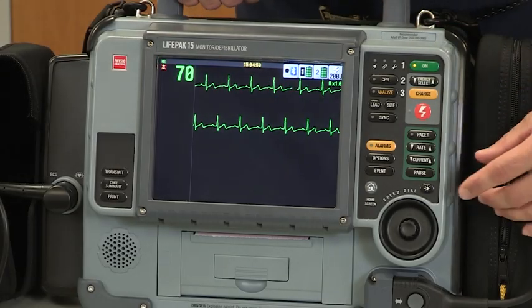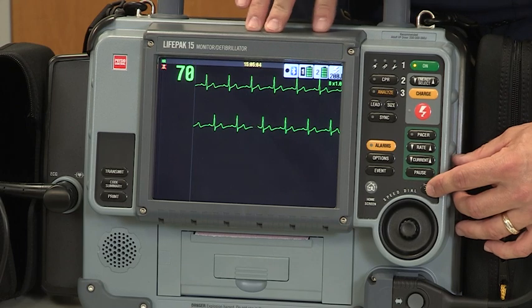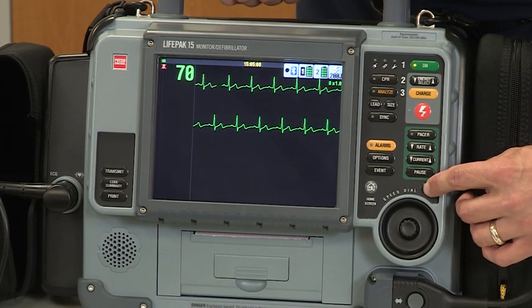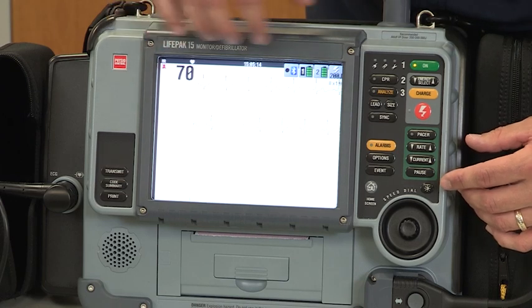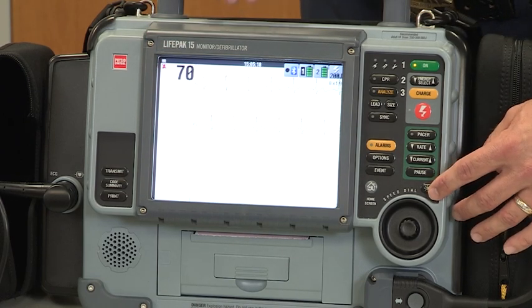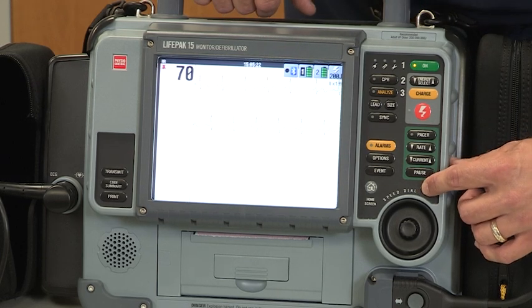Another option that's new to us on the LIFEPAK 15 is the day-night feature for changing the screen from black to white. That button is located right here above the speed dialer. Just simply push it and it changes your background to white. I realize with the camera you probably can't see that black tracing very well, but I encourage you to play around with it and see what you like once the LIFEPAK gets to your station. I actually prefer the black background, so I'm going to switch it back.